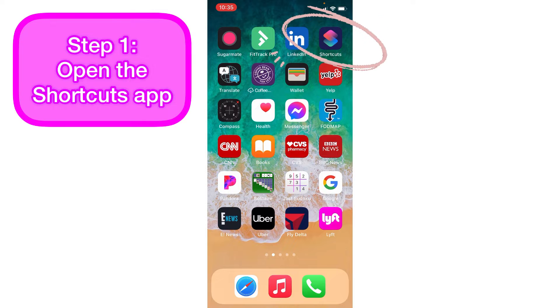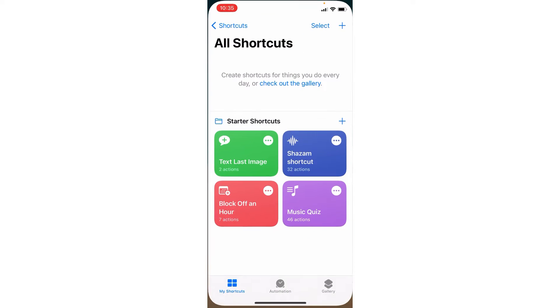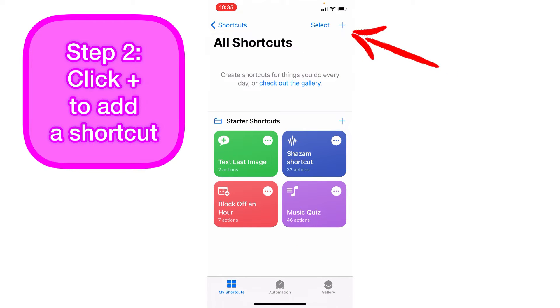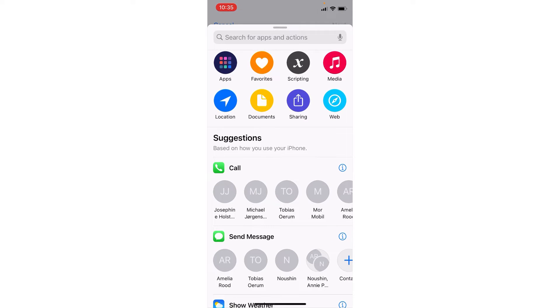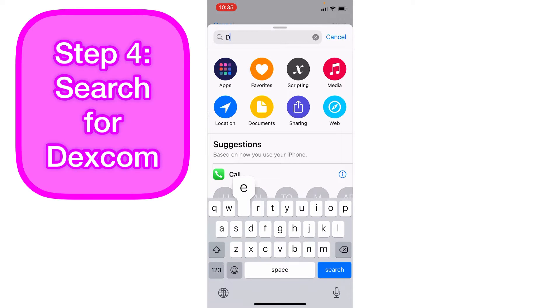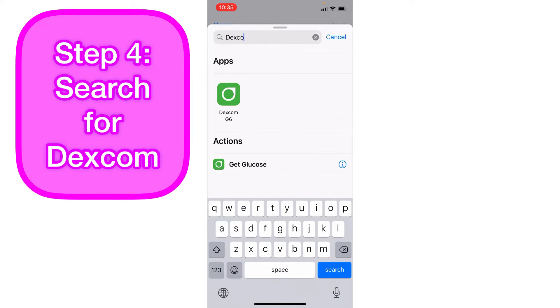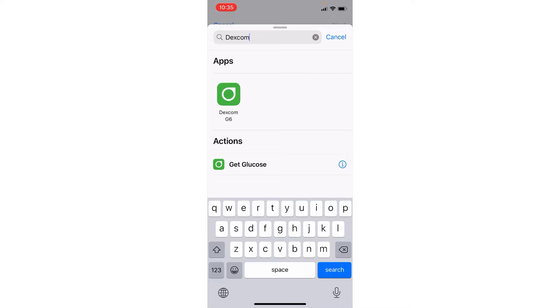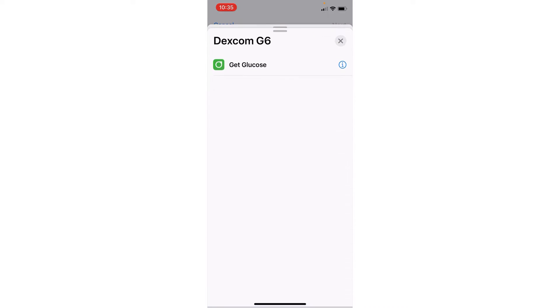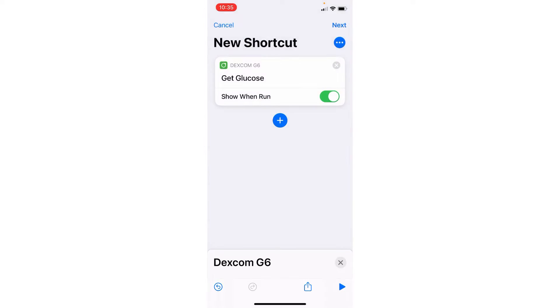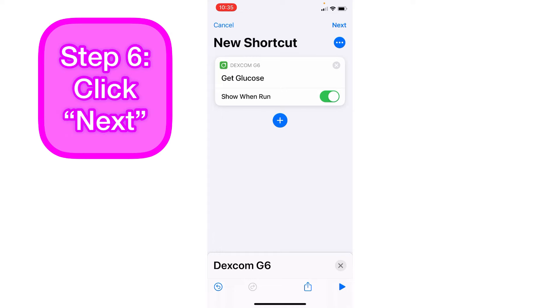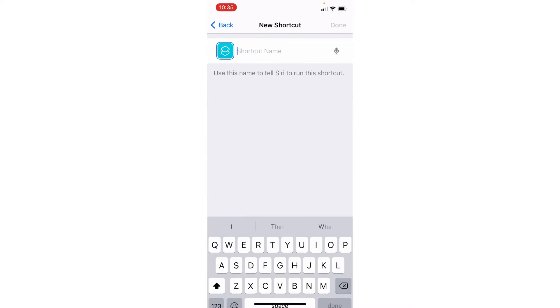Let me show you how to do that. Open your phone and find the Shortcuts app. Press the little plus sign in the corner to add a shortcut, then tap 'Add Action' and type in Dexcom. Choose the Dexcom app, click on it, then click on 'Get Glucose,' and then click Next in the right-hand corner.